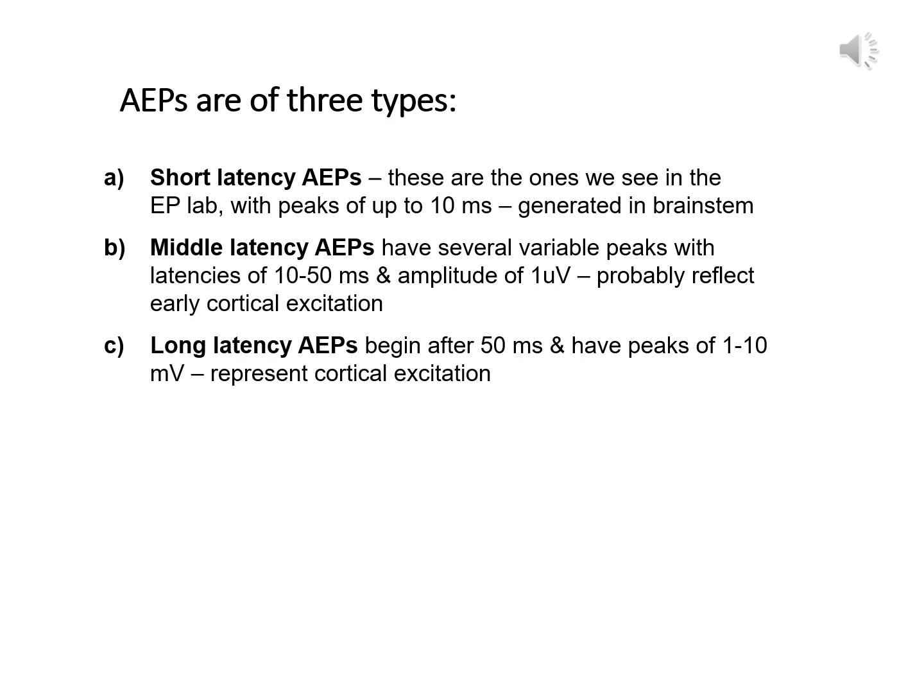And then the long latency auditory evoked potentials begin around 50 milliseconds, and they have slightly bigger peaks, up to 10 millivolts. And they represent activation of the auditory cortex. And so again, in our lab, we only look at the short latency AEPs, or the brainstem auditory evoked potentials.